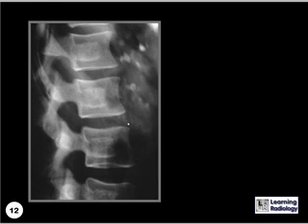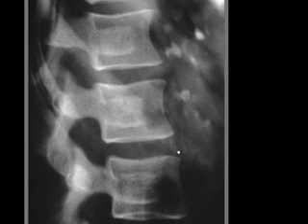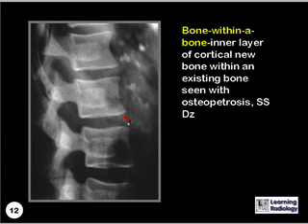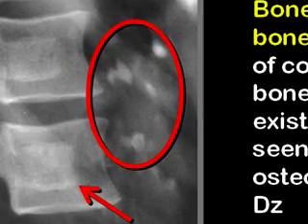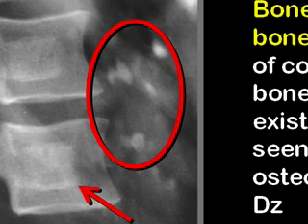What sign is demonstrated here? This is a bone within a bone, which is an inner layer of cortical new bone within an existing bone. It can be seen with osteopetrosis and sickle cell disease. In this case, these are ghost vertebrae, seen with thorotrast injections in childhood. The red circle is demonstrating the dense contrast-filled abdominal lymph nodes, which still contain the thorotrast.